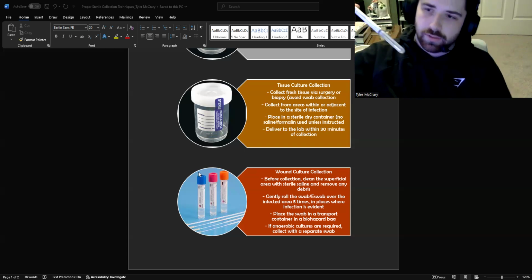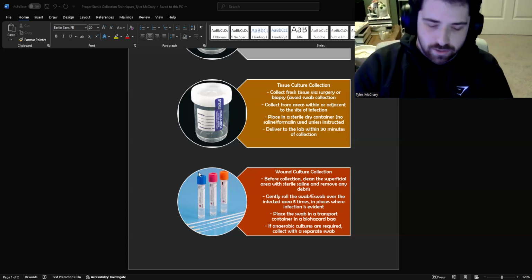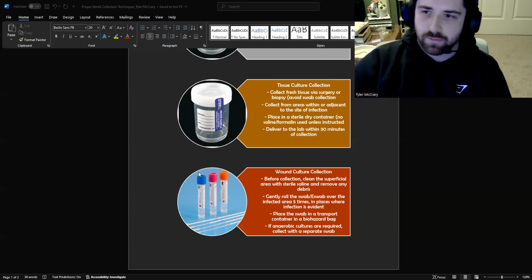And this is an example of an e-swab. There's a diluent at the bottom. And what this allows you to do is it is sterile, it is sealed. You just twist the top open. And again, you would just rub the area of infection five times, place it back in.